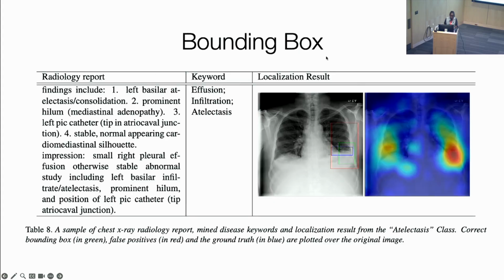So here is an example of a bounding box. There's quite a lot of intersection using the saliency maps, which just show us where the model is looking, trying to narrow down where the abnormality is. And bounding boxes are easier for radiologists to do. They can do them faster. Really, to me, if you can label some subset of your dataset that way, it's better. I can tell you that we've used, for example, publicly available datasets with bounding boxes, converted them to classification tasks to do our labeling for our own dataset.